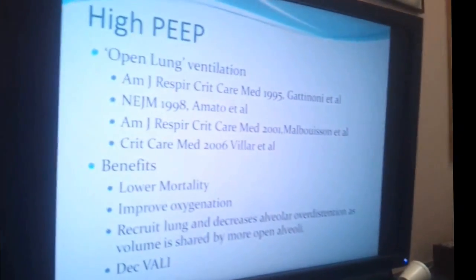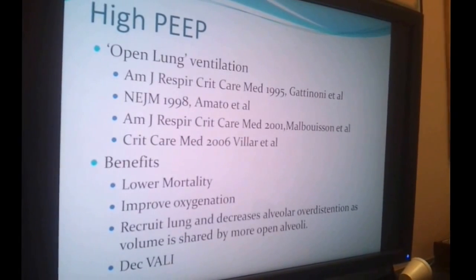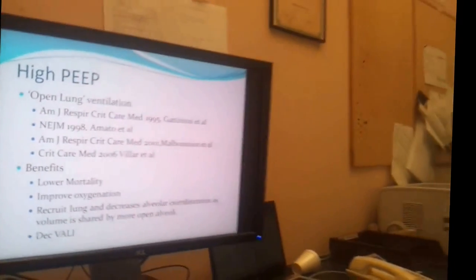Second thing, how much PEEP should we give? Now, what is PEEP? I haven't put that in there, but what is PEEP? PEEP is positive end expiratory pressure. It is the amount of pressure which should be kept at all times in the airways, from the ventilator to the tubing to the trachea to the lungs, all in one column. The dial PEEP means that a certain amount of pressure, 5 or 10 centimeters of water, whatever you're using, will stay constant.